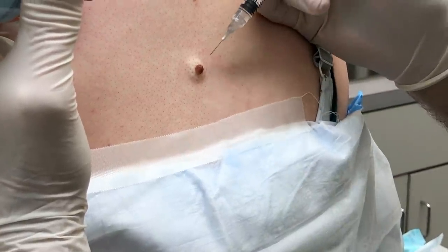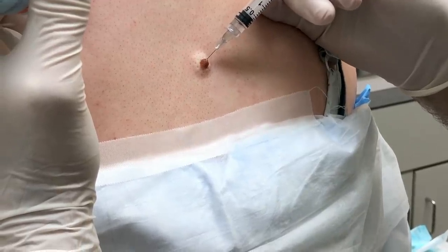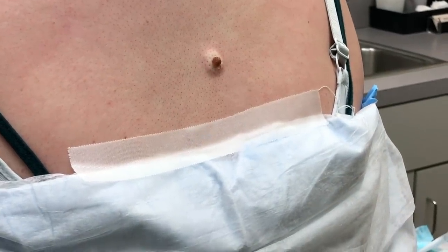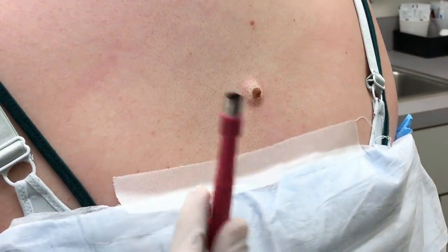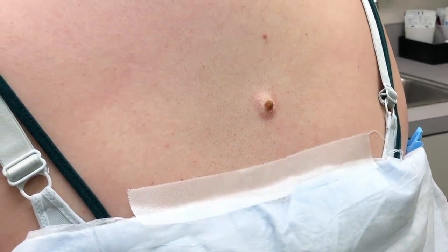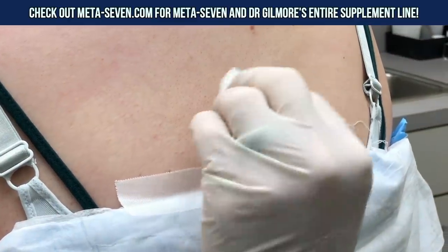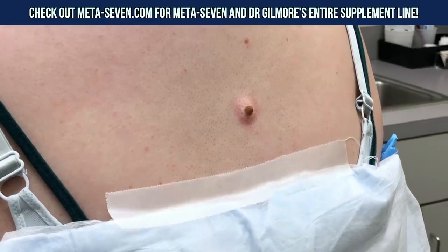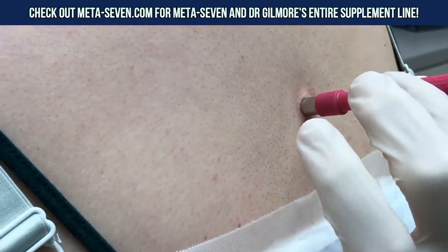The whole mole changed colors. Put a little bit more in for you. There we go. So what we're gonna do is what's called a punch biopsy. This is a little tool that we use to do biopsies. In this case, it's large enough that we can actually do the biopsy and remove the mole at the same time. Pretty cool, huh? All right. So we're gonna put that right over the mole and then just twist gently.